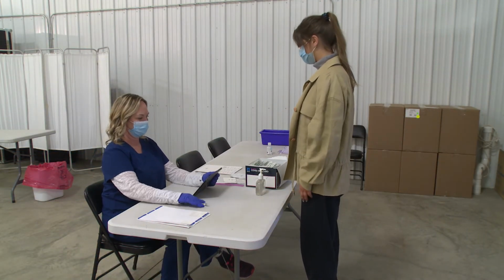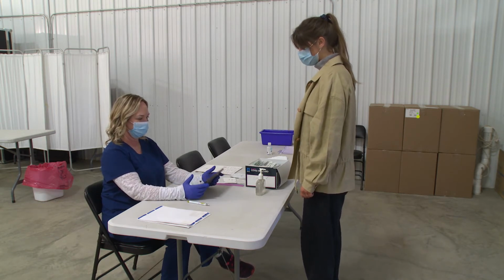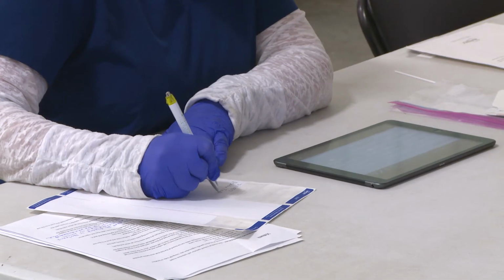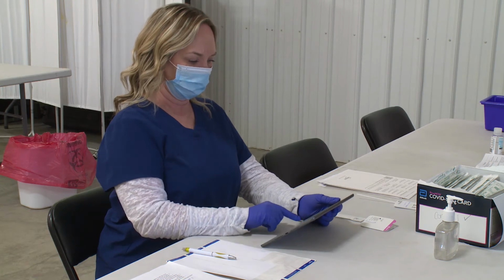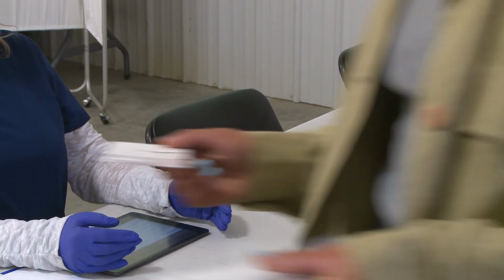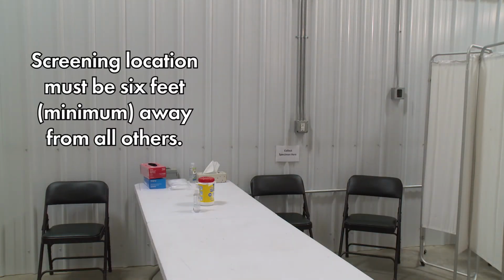The day of your event, after somebody has registered, they would come up to a registration table, and at that table, your facilitator would ask for their name and date of birth, search for that name and date of birth within Power Apps, and also write that information on a label. You would link that Binax test card within Power Apps to that specific individual, and then you would give that test card to the individual who's being tested. They would then take that card back to the location where the testing is occurring.